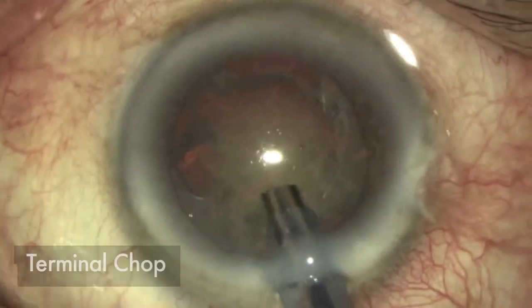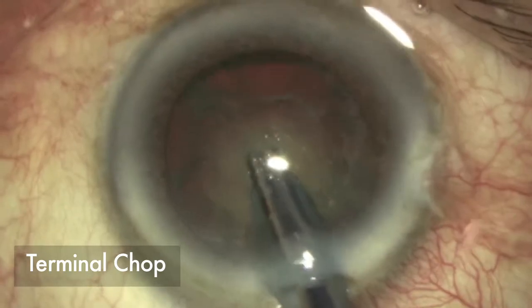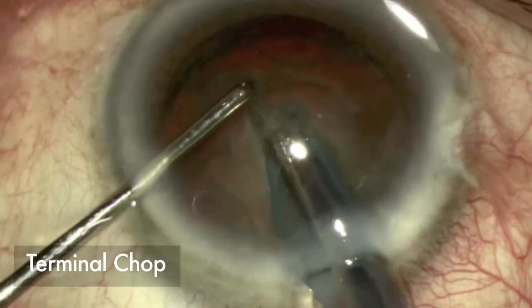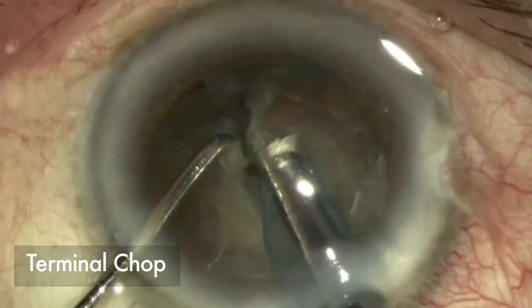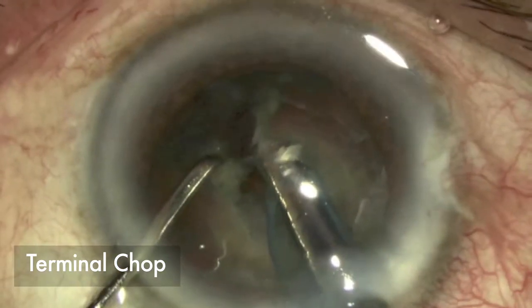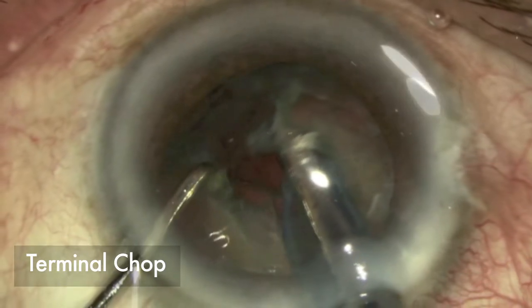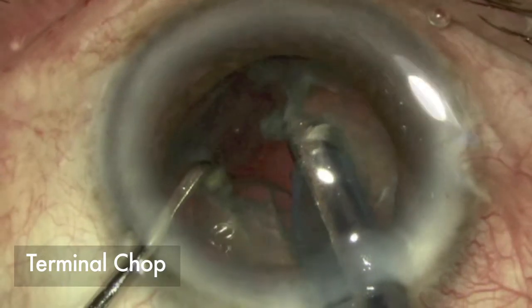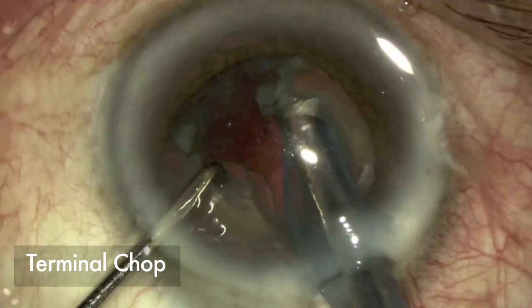In terminal chop, instead of compressive forces, dispersive mechanical forces are used at the thinnest and weakest equator of the nucleus. Without penetrating deep into the nucleus, the phaco probe achieves a firm hold of the nucleus at the equator along with a blunt chopper. Lateral separation force initiated at the equator simply traverses through the entire nucleus and results in full-thickness nuclear segmentation.